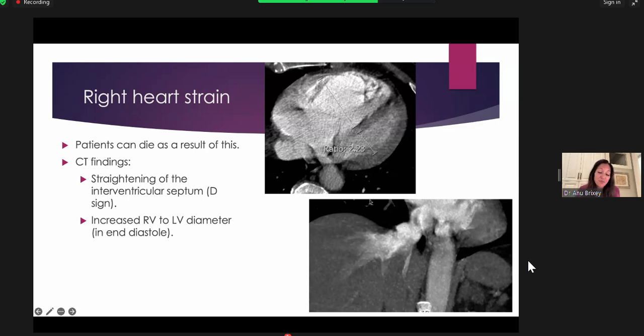But what I do, and if you know how to do this and you have the ability to do this, this is what I recommend. We have basically an independent workstation that's linked to our PACS system that allows you to make 3D measurements. We use something called Philips IntelliSpace Portal, but you can use any version of this sort of portal where you can essentially pull up the images in all 3 imaging planes, and you can manipulate the images so that you can get a perfect orthogonal.